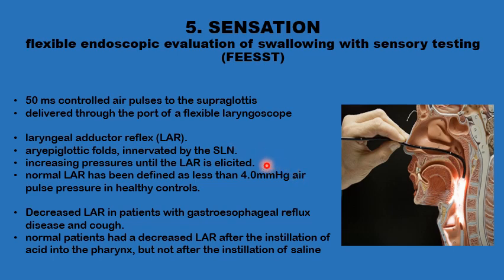If more pressure is required, or if there is no response at all, then we know that there is either a defective or absent laryngeal adductor reflex. This reflex is reduced or even abolished altogether in patients who have gastroesophageal reflux. It's interesting to see that even by instilling some acid on the aryepiglottic fold, the reflex would be reduced.